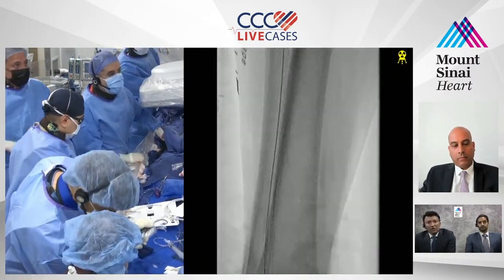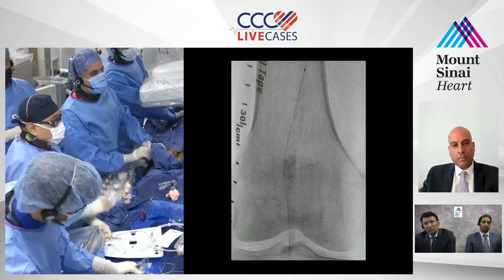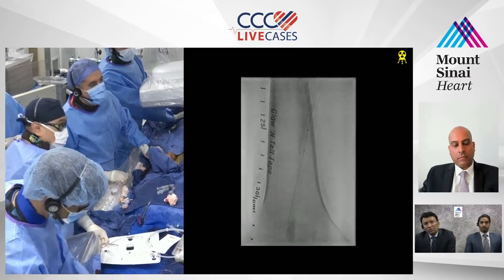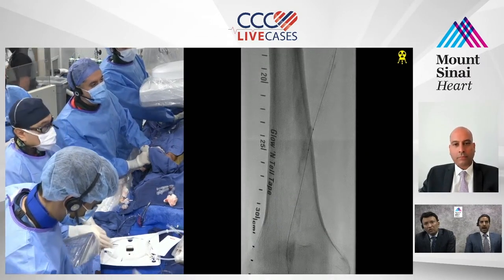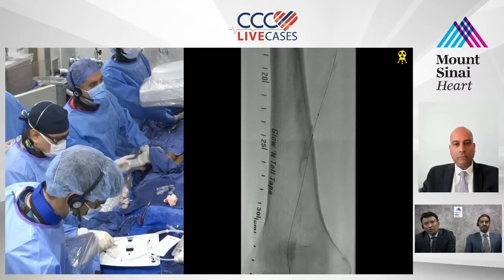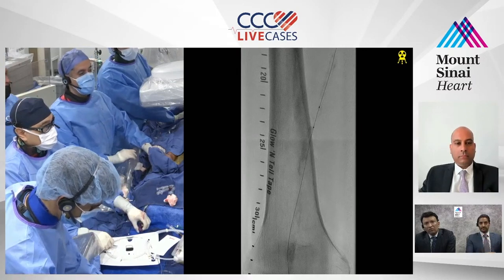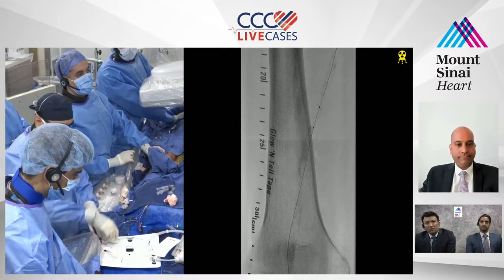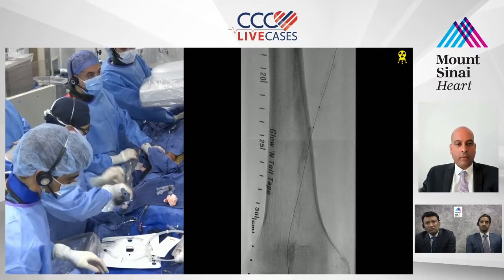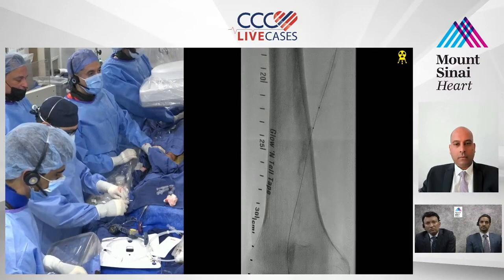But you don't think the catheter can go across the wire now? No, you never know, right? To me, let's create a plane. We have through and through access. I don't want to give that up yet. How far do you want to go on? Give it a dive from above, guys. This is the 5015, right? Viatrac. All right, ready? Go ahead, balloon this area. We know that they were luminal till the occlusion point. So I think this is the area which now is going to help you a lot.